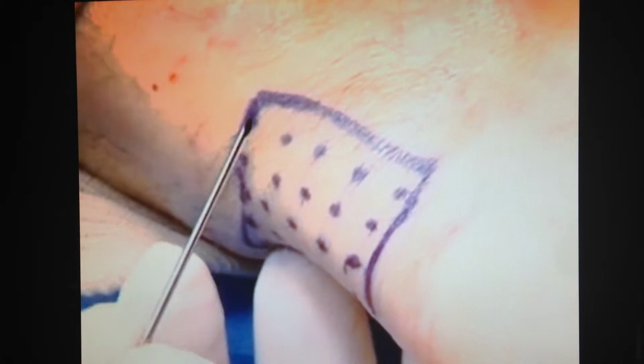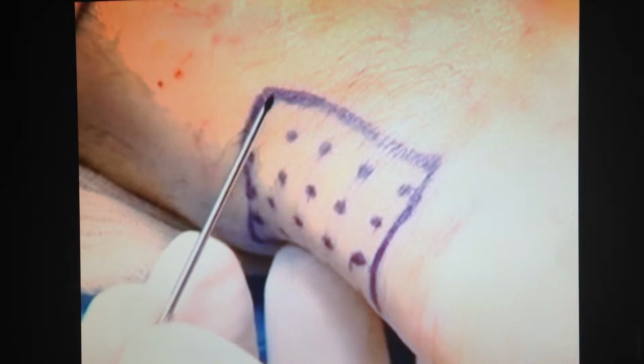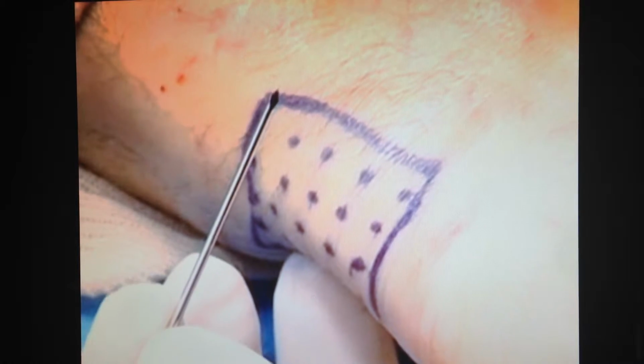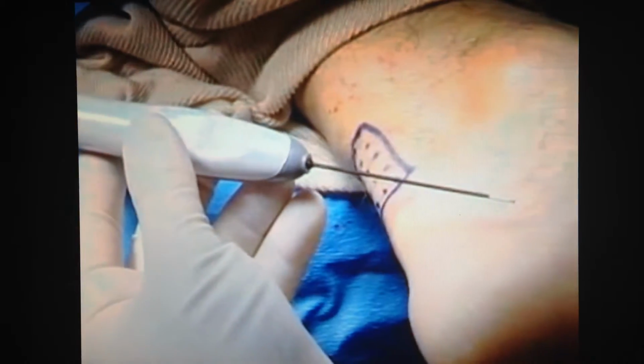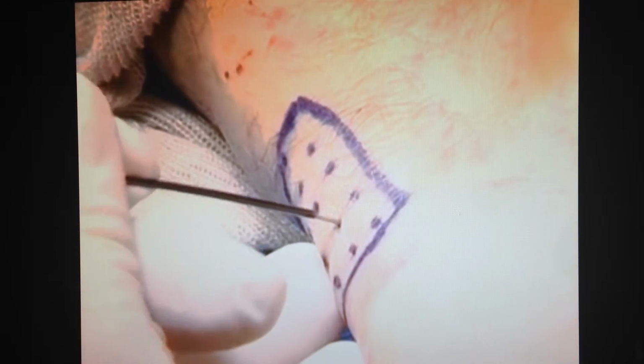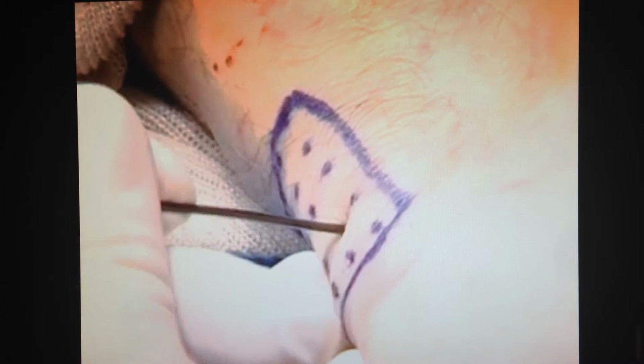Utilizing a .062 K-wire, the holes that have been mapped out will be penetrated and percutaneous incisions will be created. These incisions will enable us to introduce the Topaz wand to create the surgical correction. The Topaz wand is then introduced through these percutaneous holes. The Topaz wand is taken to the level of the Achilles tendon and not penetrated until the pedal is stepped on, and then the wand is penetrated, releasing the Topaz frequency to stimulate the healing process. All holes are utilized throughout the procedure at different angles, penetrating the tendon.